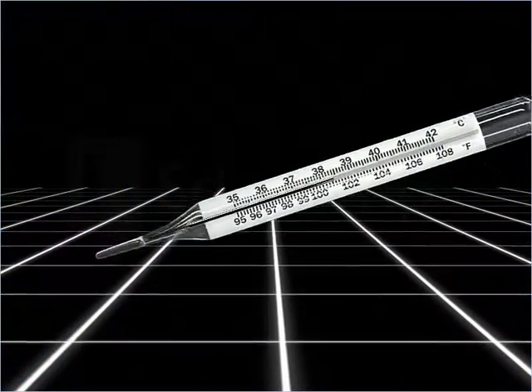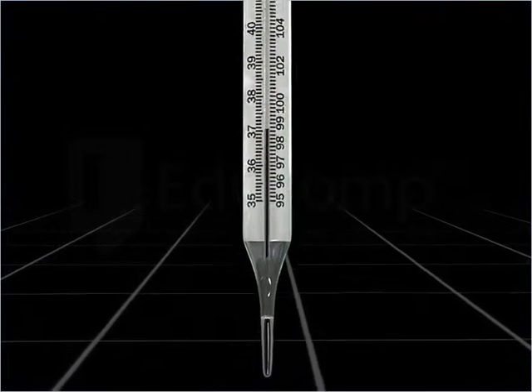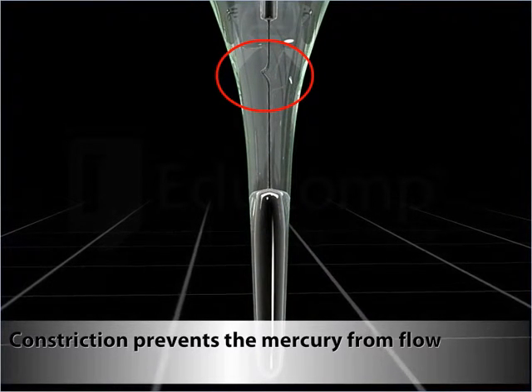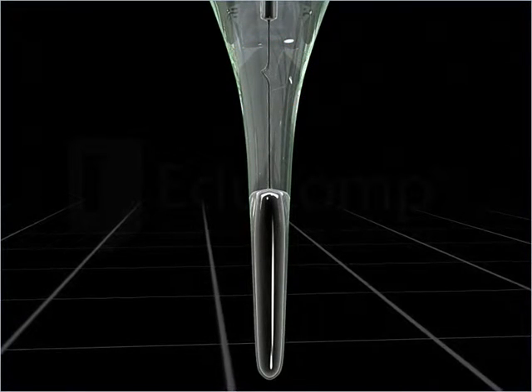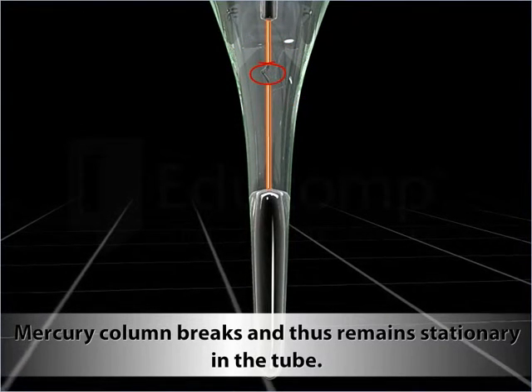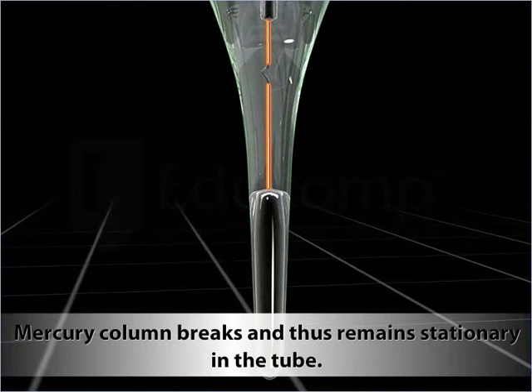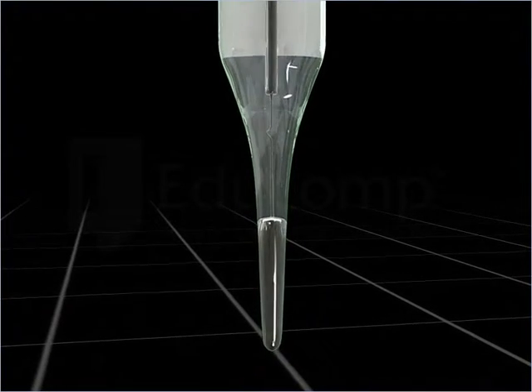You may be wondering if the reading changes on removing the thermometer from the mouth. Well, it does not. The constriction prevents the mercury from flowing back into the bulb. You can also say that the mercury column breaks at the constriction and is unable to return to the bulb, thus remaining stationary in the tube.